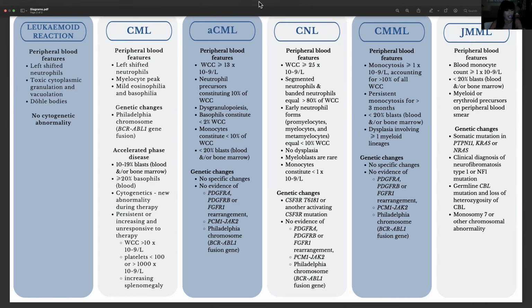I just always review the peripheral blood slides in a systematic process, and try to evaluate all the morphological features, including overall cell size, the nuclear characteristics, the cytoplasmic appearance, because it is important that we appropriately identify and classify these cells to help the clinician determine diagnosis and further evaluation.